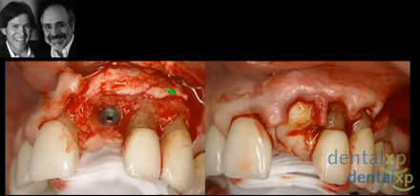And then over here, which is really quite interesting because Dennis had just shown a dermal graft. This was actually an acellular dermal graft that was placed by the previous surgeon. This is at about 4 months after the first surgery, and you can clearly see that this graft has been integrated, which is quite interesting. We don't always get the chance to re-enter these areas.